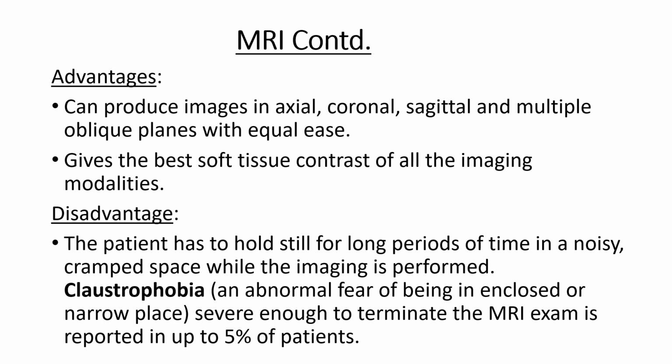The disadvantage of MRI, one of them, is that the patient has to hold still for long periods of time in a noisy, cramped space while the imaging is performed. Therefore, many of them suffer from claustrophobia, which is an abnormal fear of being in an enclosed or narrow space. Sometimes this claustrophobia may be severe enough to terminate the MRI exam, as reported in up to 5% of patients.